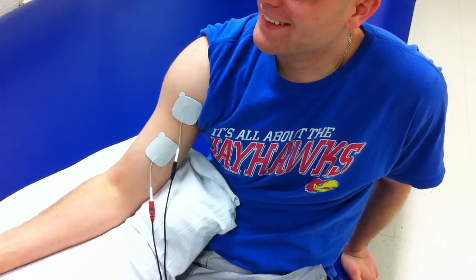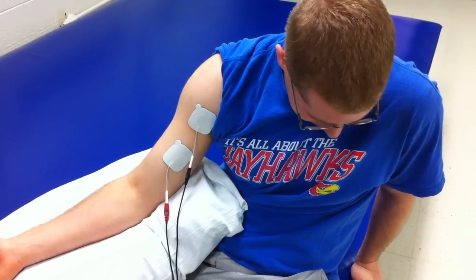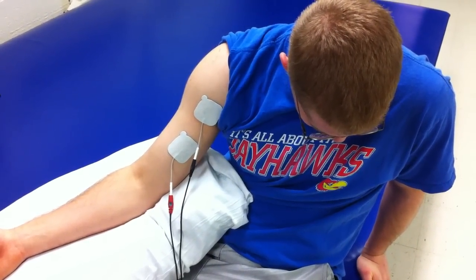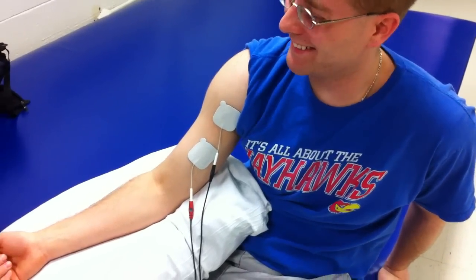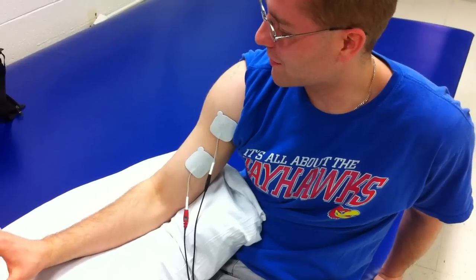We're still waiting 50 seconds. Talk about accommodation.